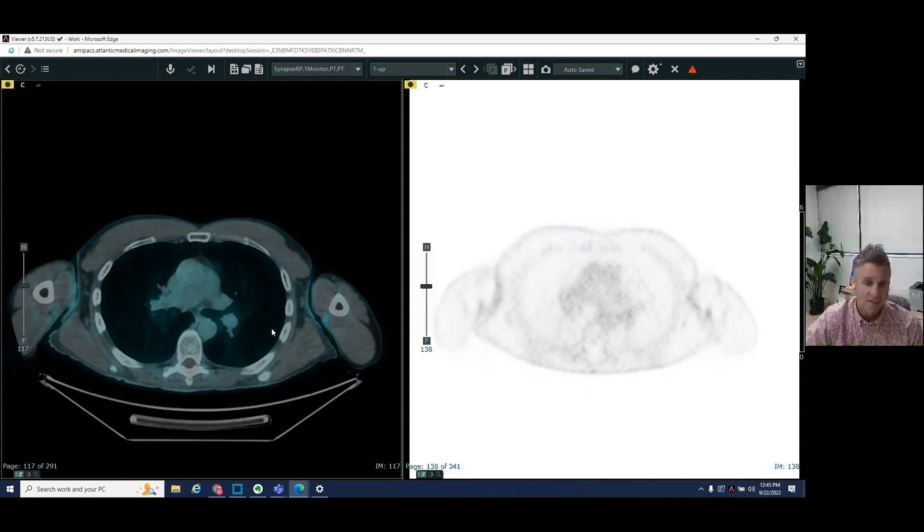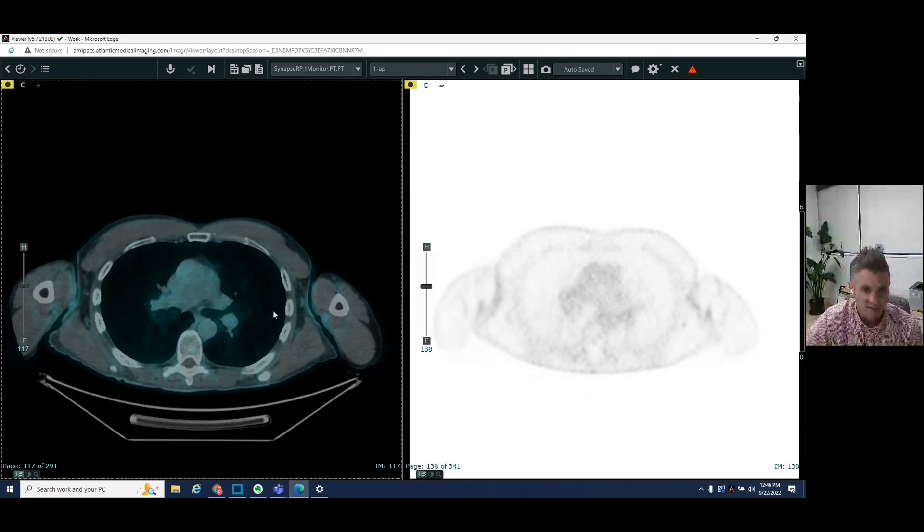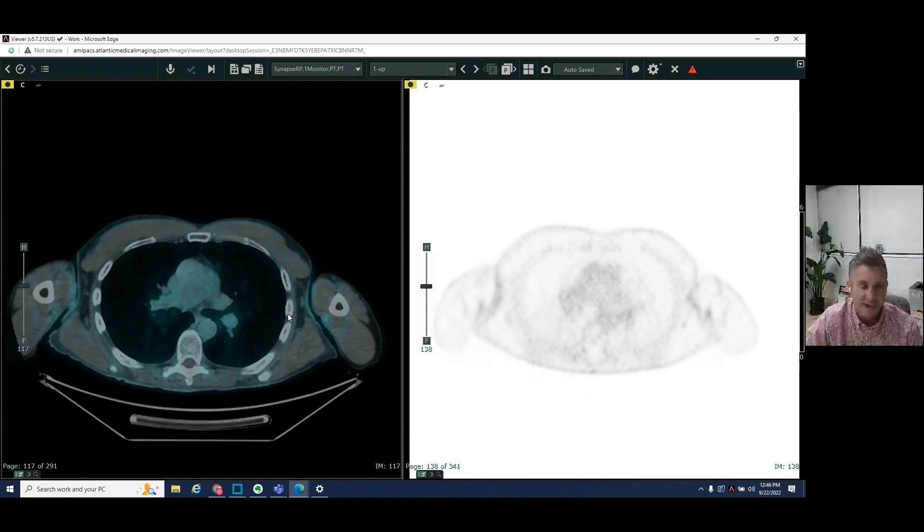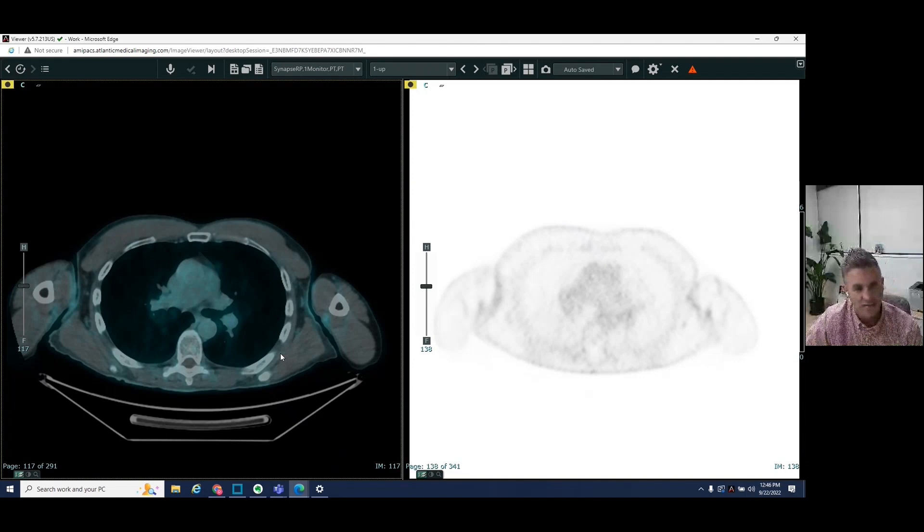So this is a patient who had a history of prostate cancer, had a rising PSA level, had a history of radiation therapy in the pelvis.